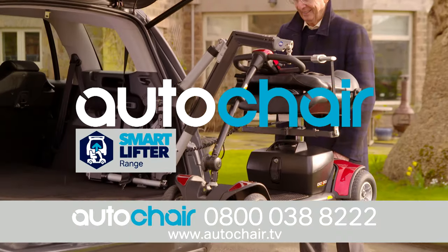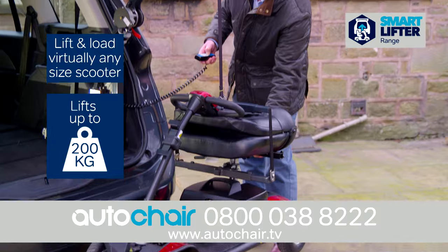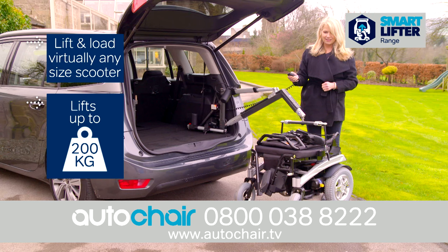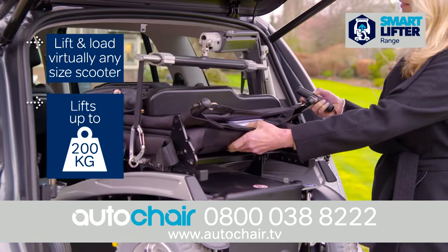Proudly presenting the SmartLifter range from AutoChair. The SmartLifter range can lift and load virtually any size wheelchair, scooter or power chair weighing up to 200kg.